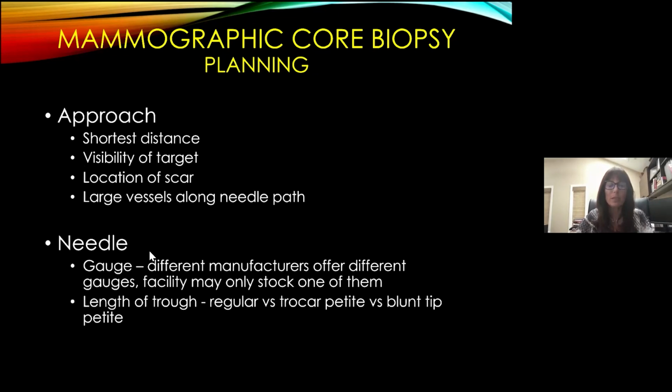The choice of needles depends on your facility and the manufacturer. In my facility, we only have one gauge available. It's a 9 gauge. We do have different lengths of trough available with this manufacturer that we use, and we have 2 available, the regular and the trocar petite, not the blunt tip petite.